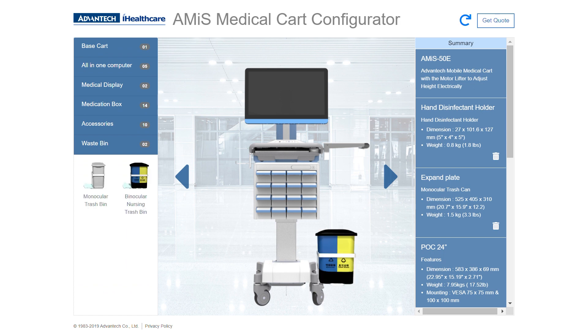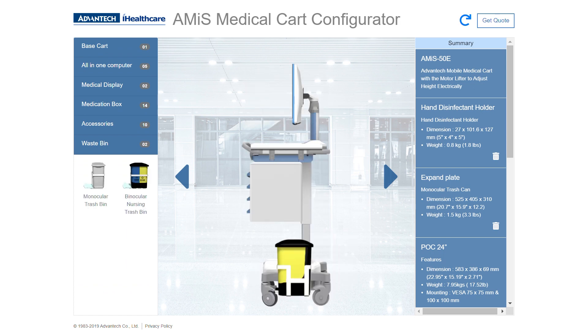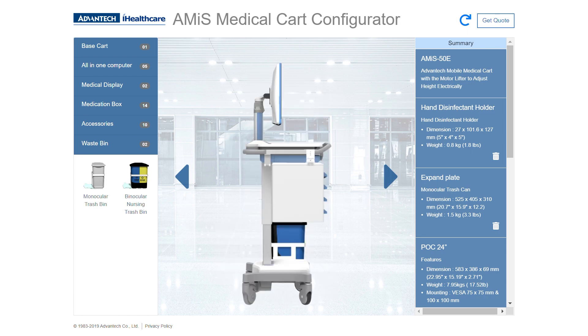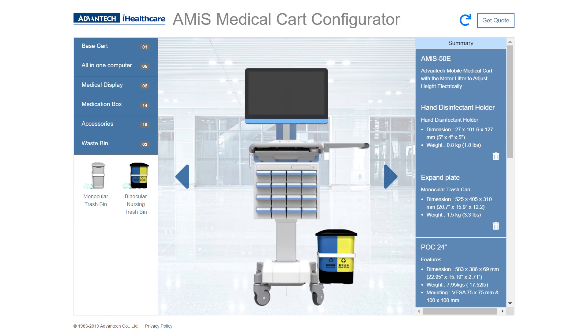Lastly, let's add a waste bin. Then if you click these arrows, you can get a full 360 view of what the cart is going to look like.